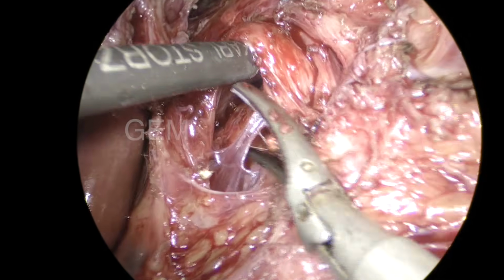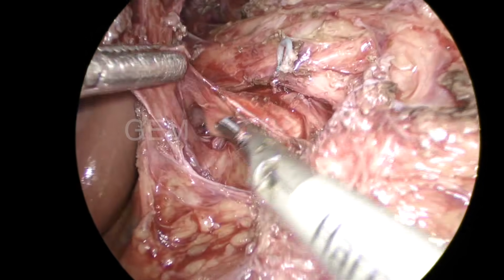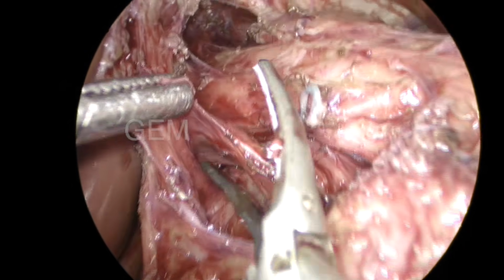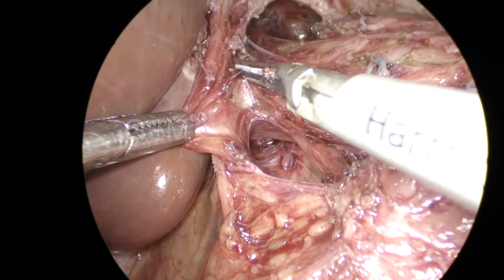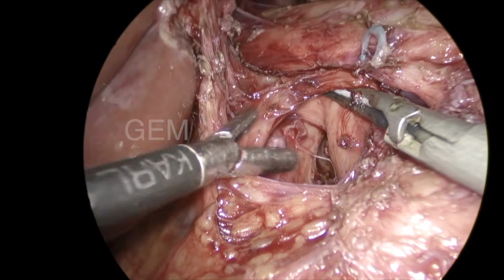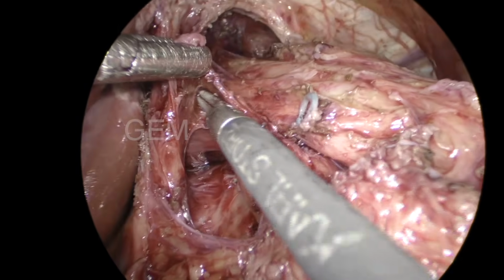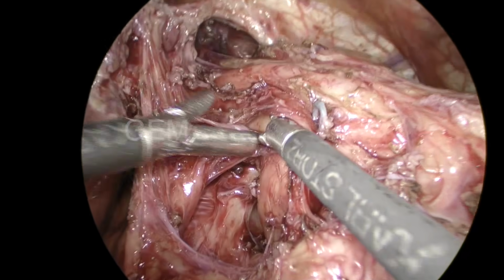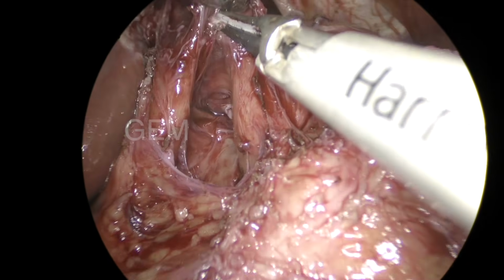Can you see the fundus wall? Yes, it is very clearly seen, white color. So that is the crus and the fundus. Now you can see the fundus, the edge of the fundus, and then these are the fibrous adhesions to the crus. Even though it's clearly seen, again I am dissecting that area. Now you can see that is the edge. Again I am dissecting to confirm the stomach is pushed down, then I am dividing.